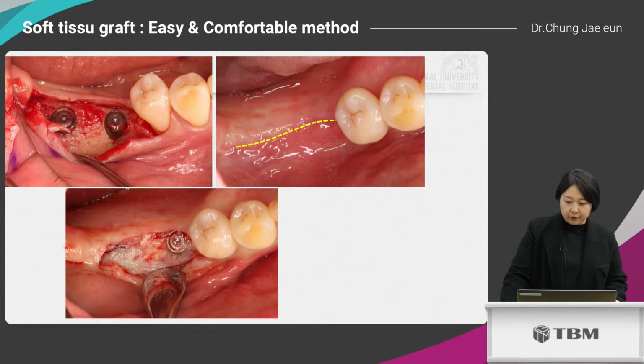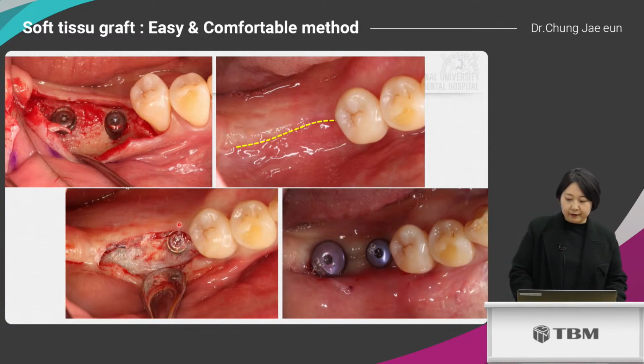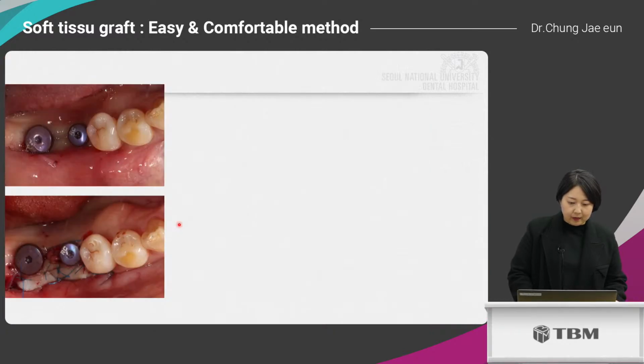During the second surgery, a very lingual incision was made here. Inside, the newly formed bone is observed with adequate thickness. However, despite the lingual incision to secure a very small keratinized gingiva, almost only mucosa remains on the buccal side after the healing abutment is connected. So, free gingiva graft was needed.